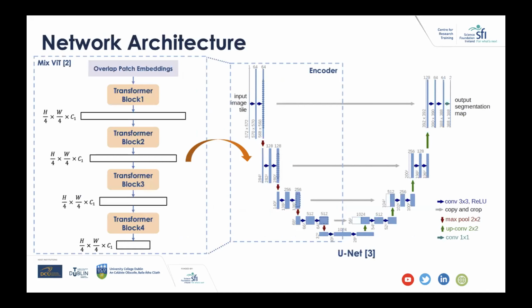So about our network, we are using the UNet, which is very popular in medical images. We designed a baseline UNet, but we made modifications on it. We thought about replacing the encoder of the UNet, because in our previous research we were fine-tuning the UNet and did a lot of experiments with different encoders in different projects. We think that if you fine-tune a UNet with a suitable encoder, you can improve the result quite a lot.